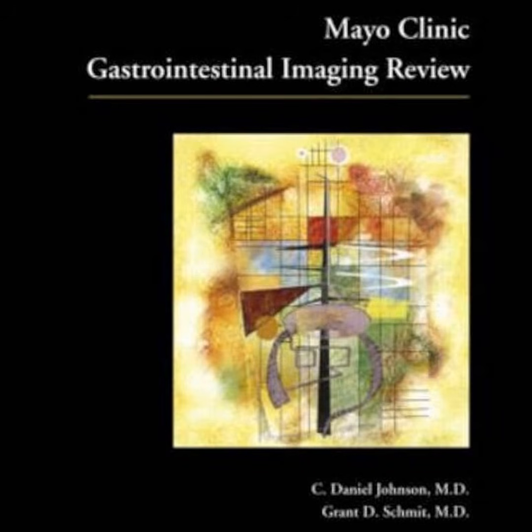But gas in the stomach region isn't always just some helpful contrast agent. Oh, definitely not. Because there's a specific radiographic pattern where gas actually indicates a diffuse lethal emergency. Which brings us to emphysematous gastritis. Yeah, and here we really have to differentiate luminal gas inside the stomach from intramural gas. Intramural meaning inside the actual tissue.